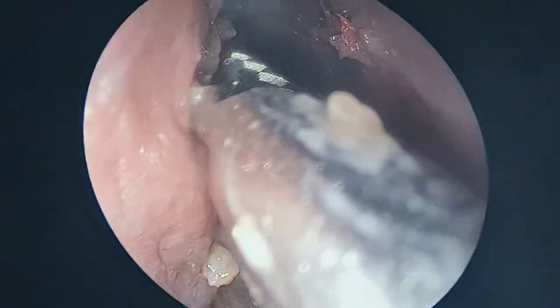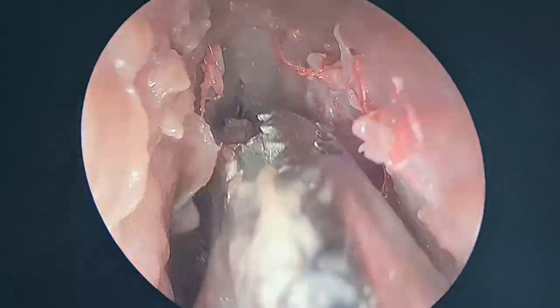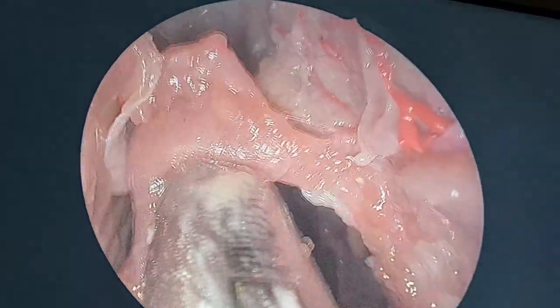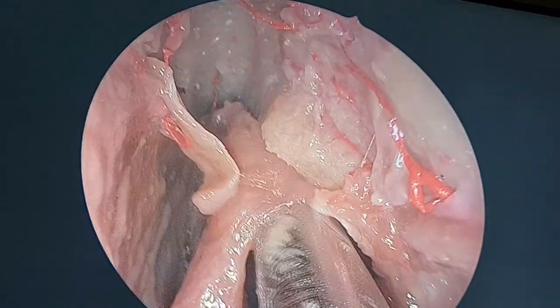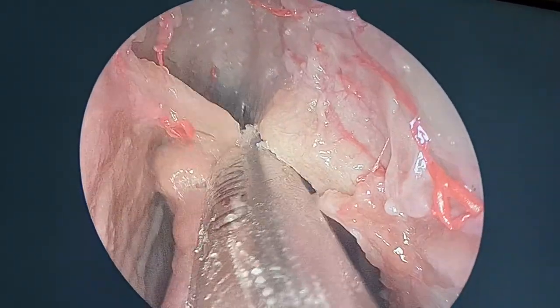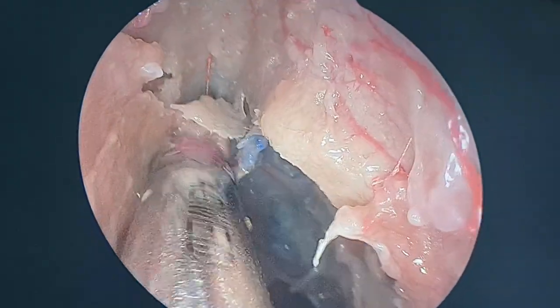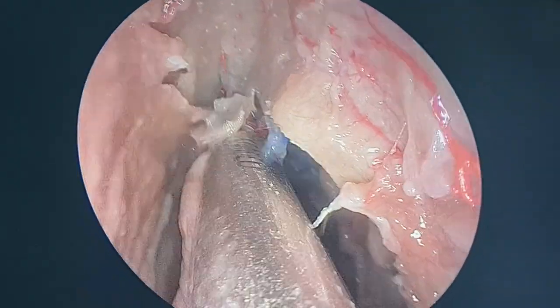This upper septum flap can be raised to drain the entire septal cavity. There are so many flaps in the vicinity. See, this is the flap which I am taking off. Okay? You have seen the limits now.